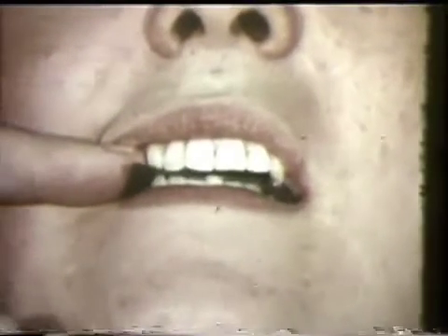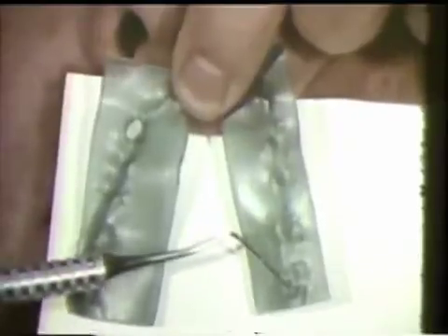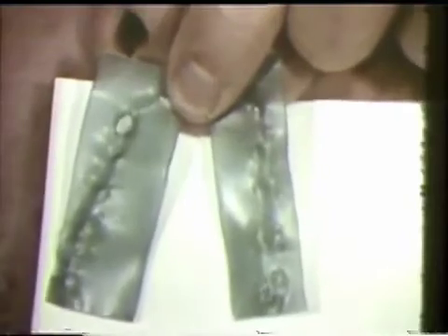Wax is placed on both sides of the mouth and the balancing side interferences are checked by having the patient move laterally. Initial contacts are on the cuspid of the working side and on the lingual cusp of the second left maxillary molar on the balancing side.